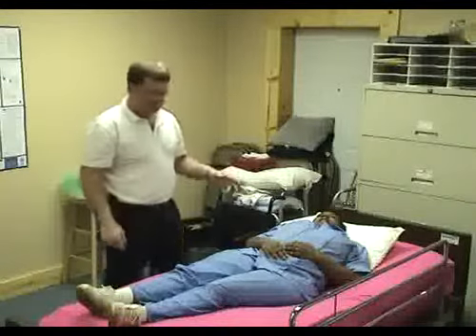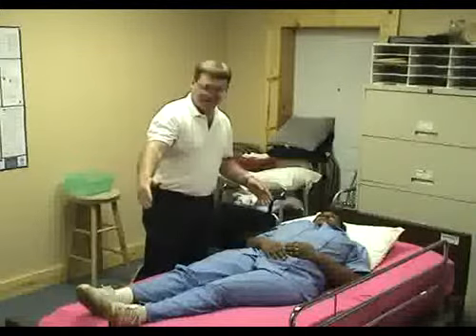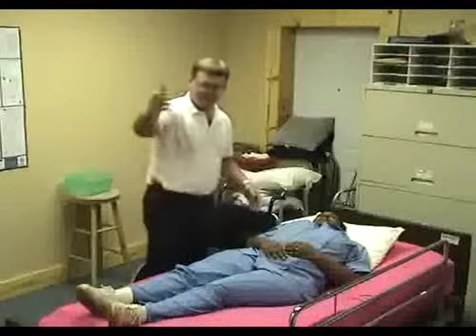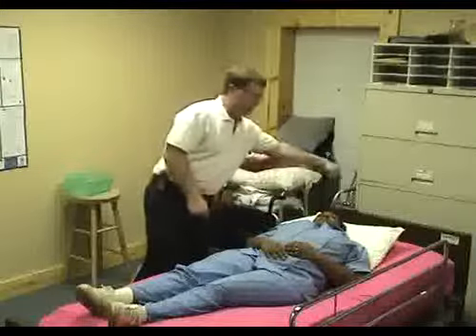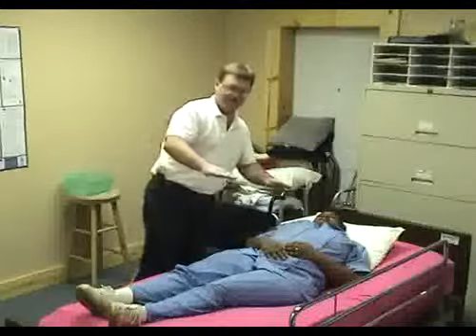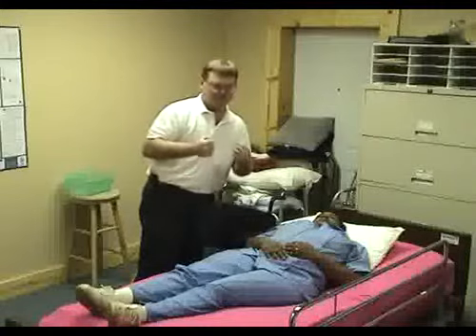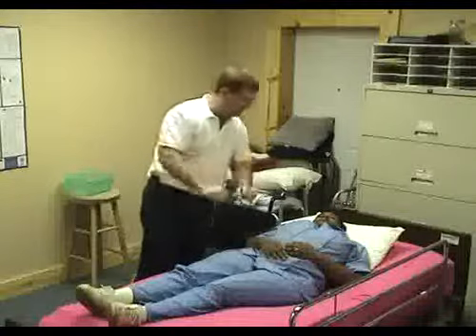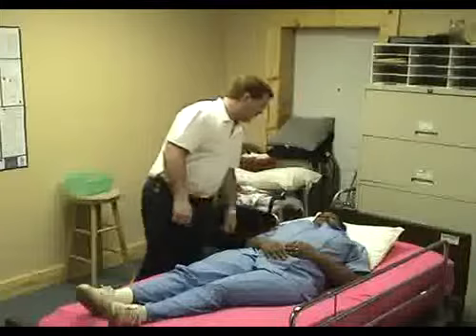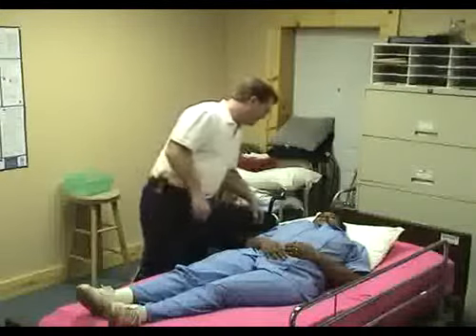I'll show you this later, but if the patient slides down too far in bed, now that we're talking about pulling, you put the feet all the way up, put the head all the way down, and get up around the top, and you get underneath them, and you pull towards you, and they're sliding downhill, so gravity's actually helping you, and you're in the pulling direction, which you should be stronger pulling than pushing with your arm. Okay, number 2 is done. She is positioned correctly toward this side of the bed that we're going to get her in and out of.